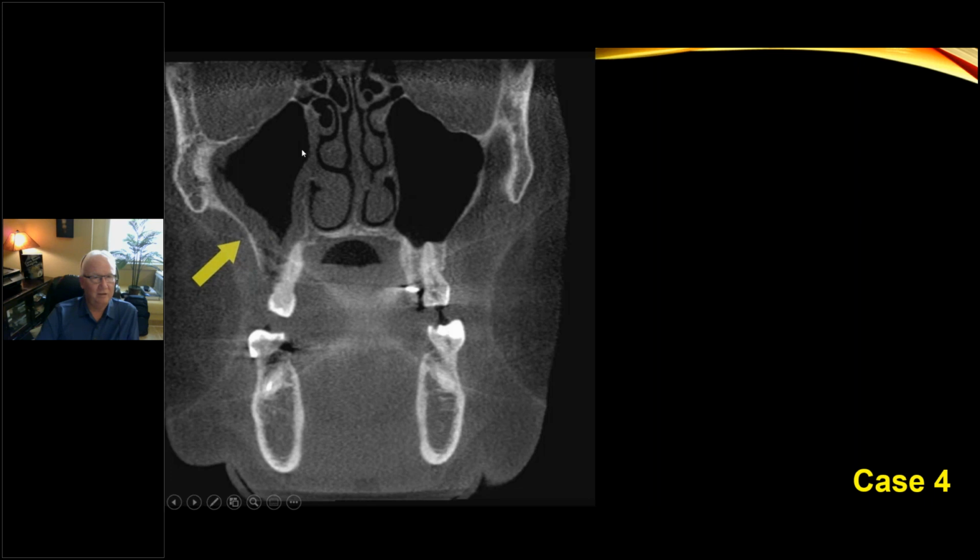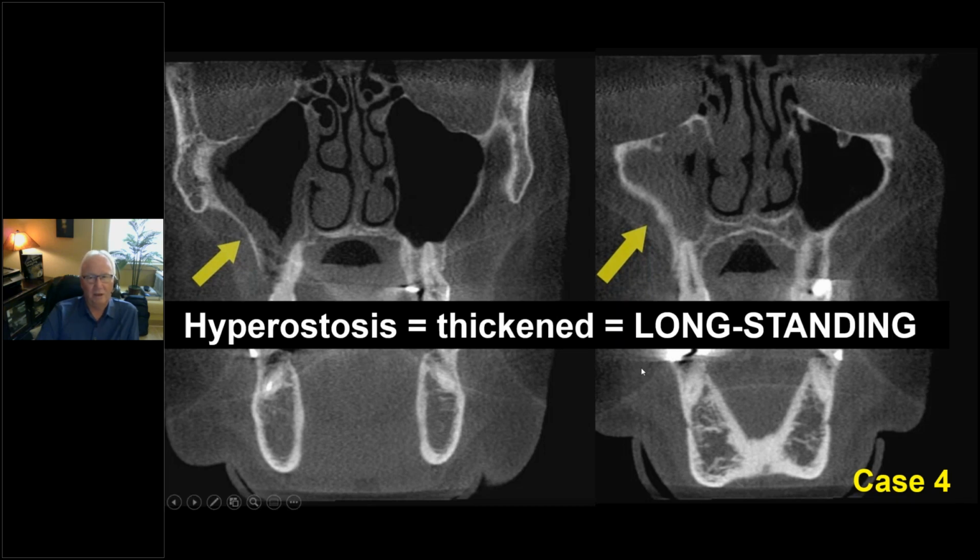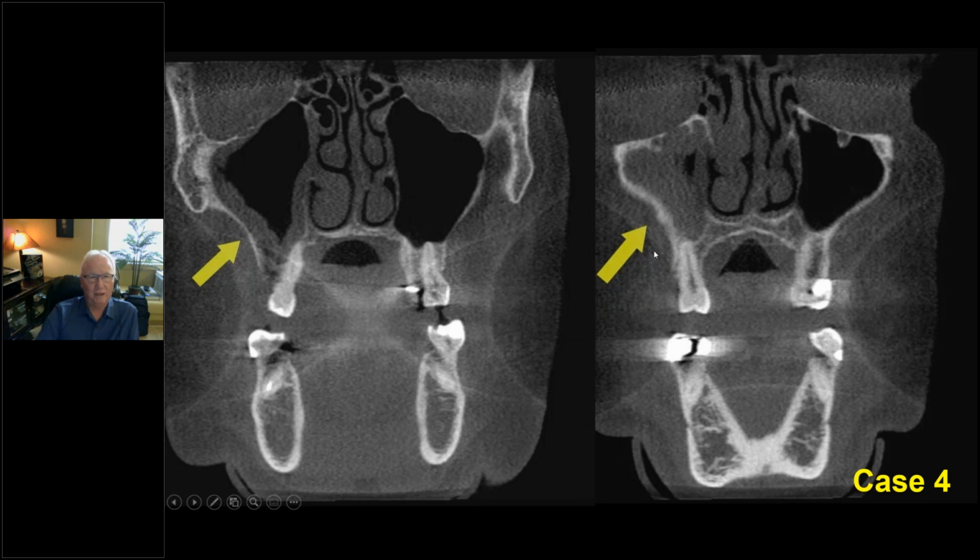And you can see all this inflammatory change. Well, it's isolated to that right maxillary sinus, and it wouldn't take much for me to say, I think the impingement of the implant into the right maxillary antrum resulted in inflammatory change that gave the patient a full maxillary sinusitis if they were complaining. So I want you to pay attention to the radiographic changes.